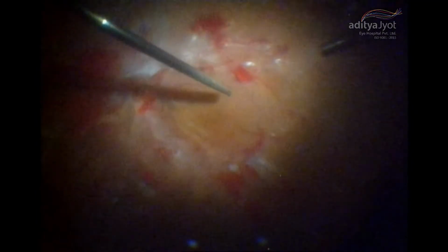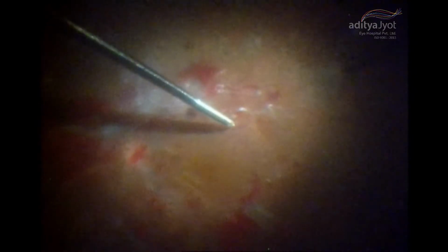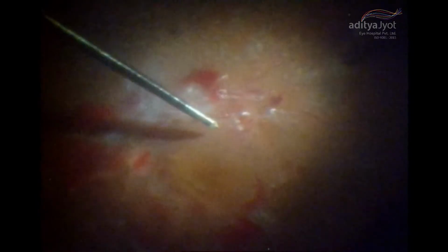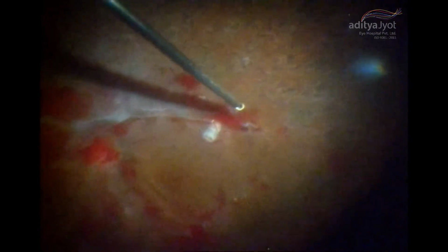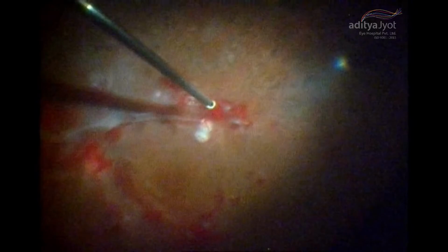And I again make sure that all the traction on the posterior pole is being removed, and I'm now using bipolar diathermy to diathermize the vessel which is bleeding, so that recurrent hemorrhage does not happen. Again using the cutter. So this is an advantage where you see already excellent laser done, but in spite of that the fibrous proliferation progressed and produced traction on the macula.